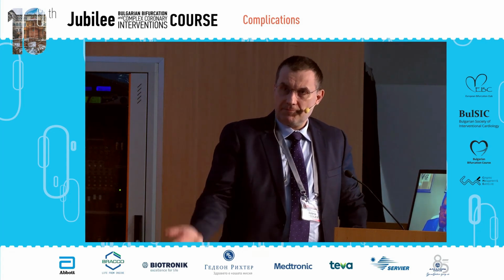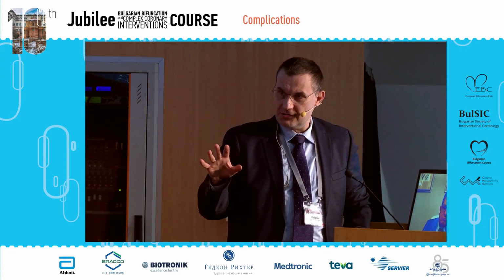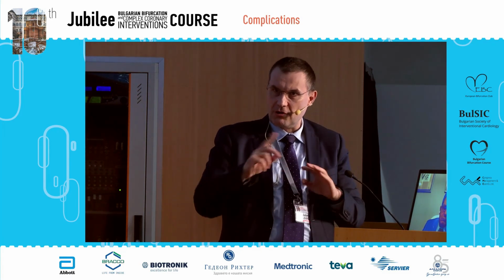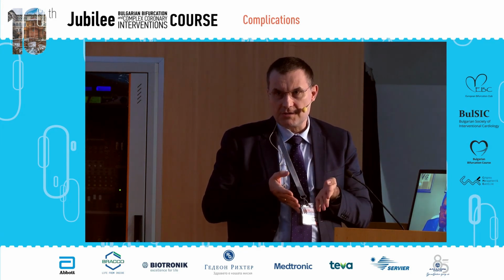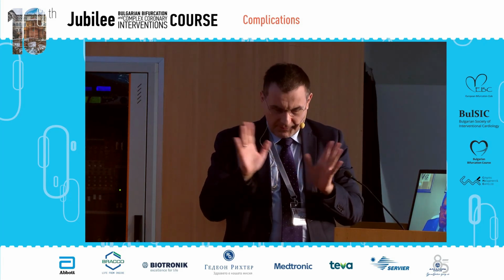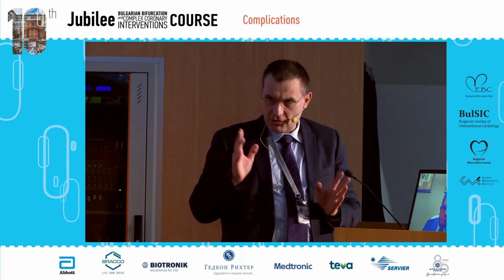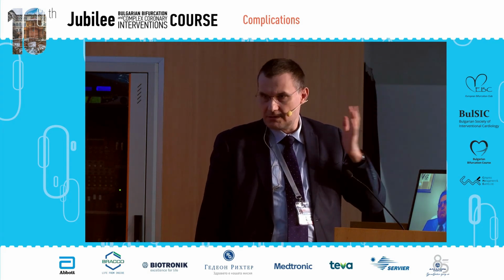In this way, you escape all the distortions which appear with kissing, with POT, side branch POT, all the techniques. This is the first technique which ensures complete coverage with two balloons, escaping all the deformations which can occur during kissing or POT.